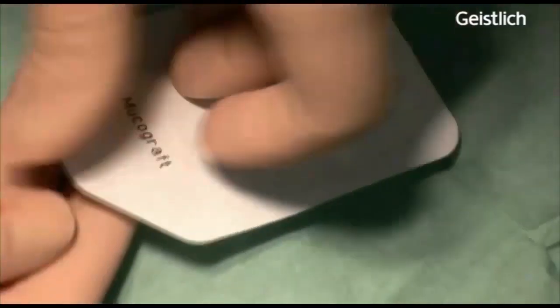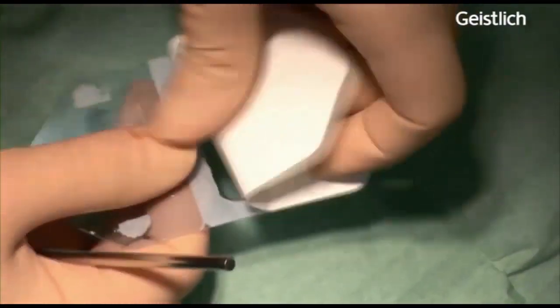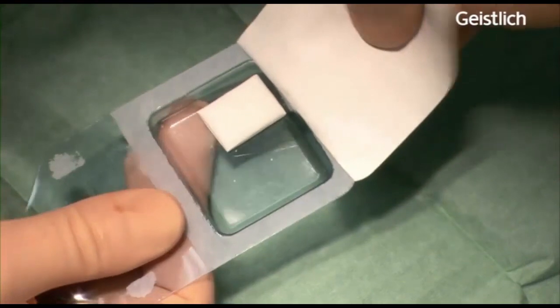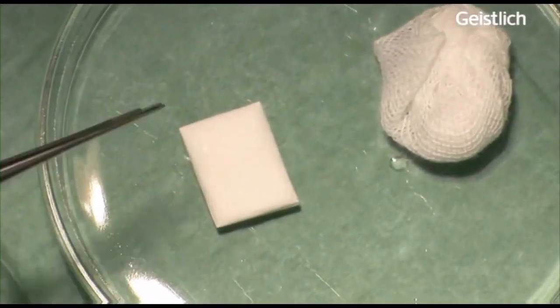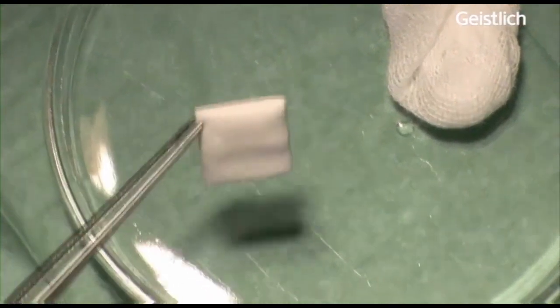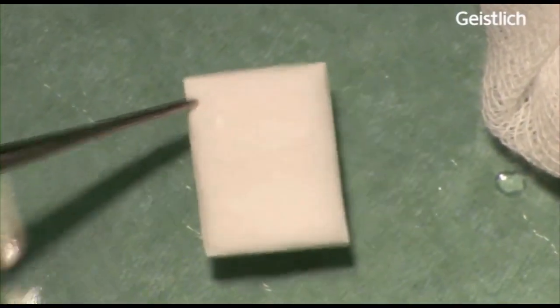The sterile double-packed mucograft package is opened, the matrix transferred to a sterile tray and trimmed to the appropriate size in dry state. Mucograft is a three-dimensional collagen matrix of porcine origin, serving as a soft tissue substitute.